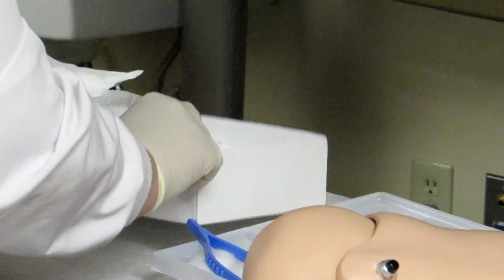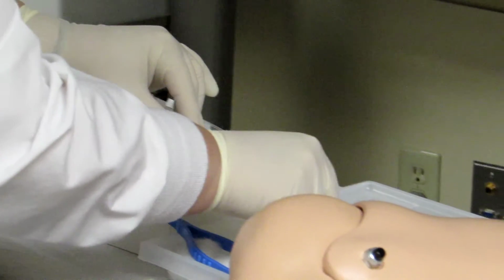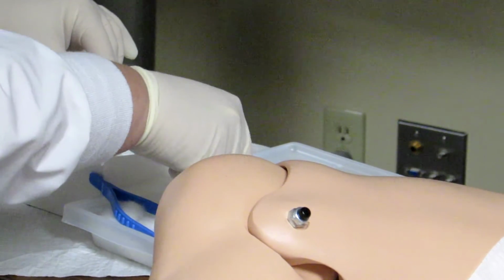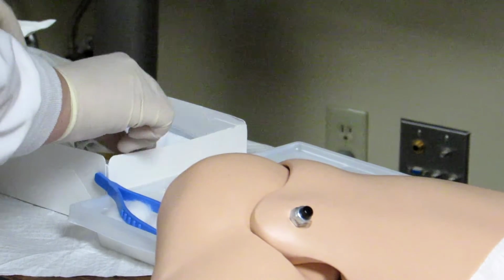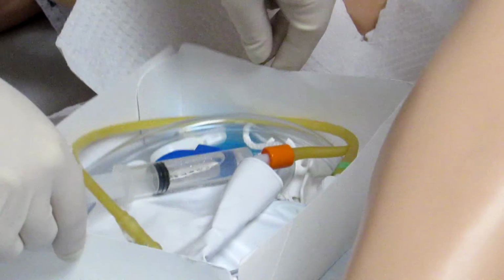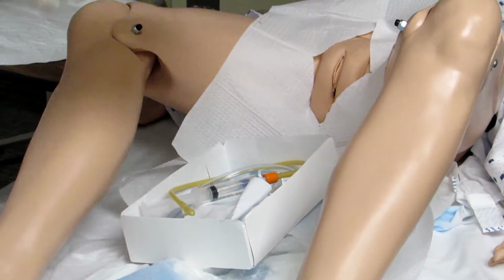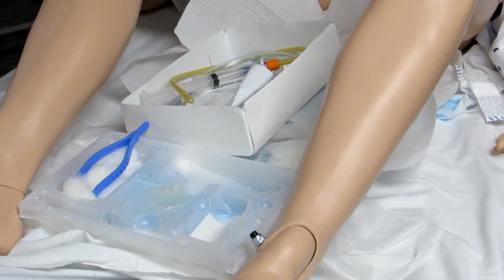Actually, I'm going to lubricate before I move to the bedside. I prefer to lubricate while I'm up here and just put the lubricated catheter back in. You're going to lubricate about 2 inches so it's nice and a little more comfortable for your patient. I'm going to move my Foley catheter box here. I'm going to put it right up close to the patient so that when I'm ready to insert, I can have my catheter right there ready to insert. Now I'm going to move my extra lubrication and my cleansing swabs over here as well.